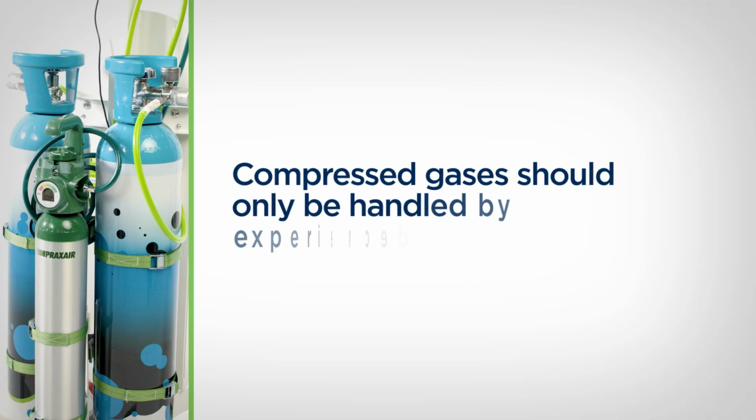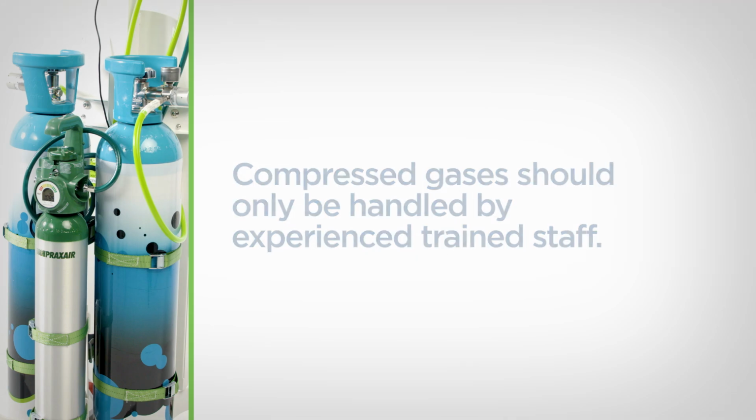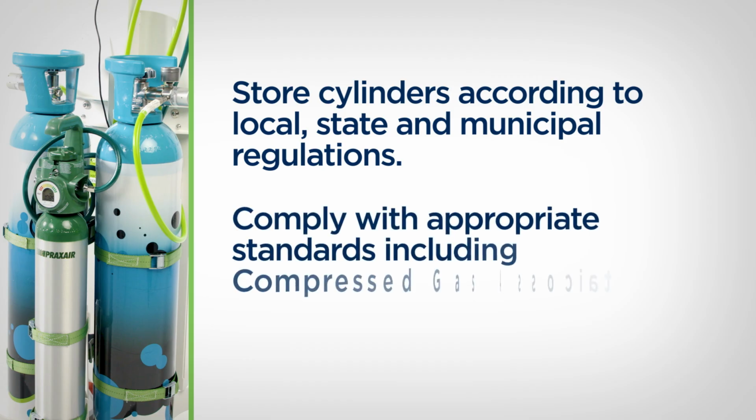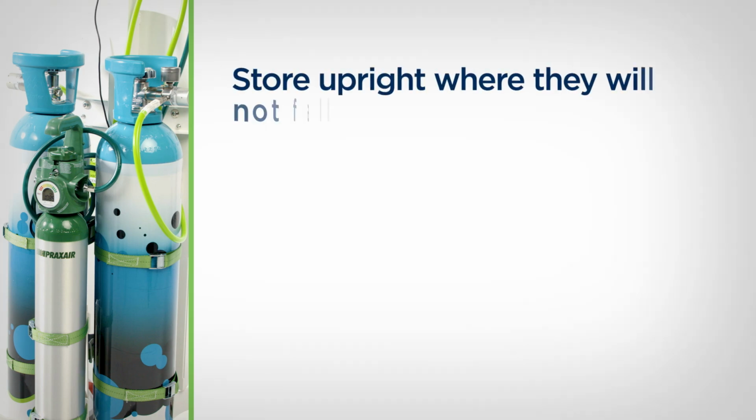Compressed gases should only be handled by experienced and properly trained staff. Cylinders should be stored in accordance with all local, state, and municipal regulations and in compliance with appropriate standards, including, but not limited to, the Compressed Gas Association and the National Fire Protection Association. Gas cylinders should be stored upright where they will not fall over or be damaged by falling objects.